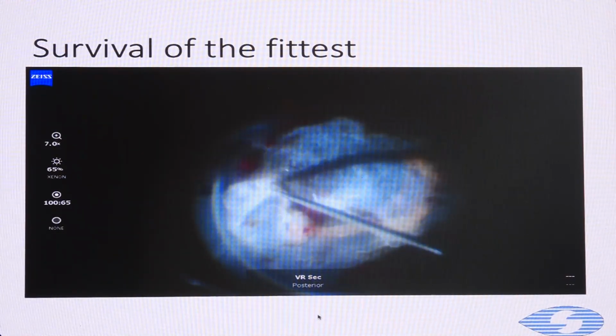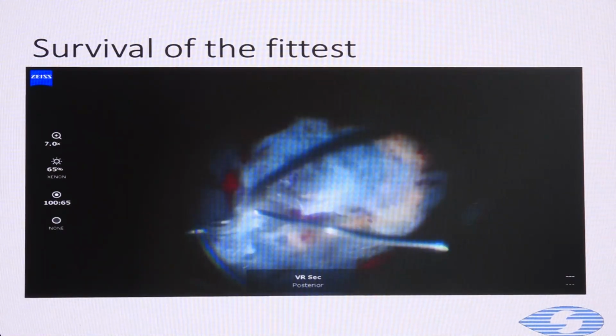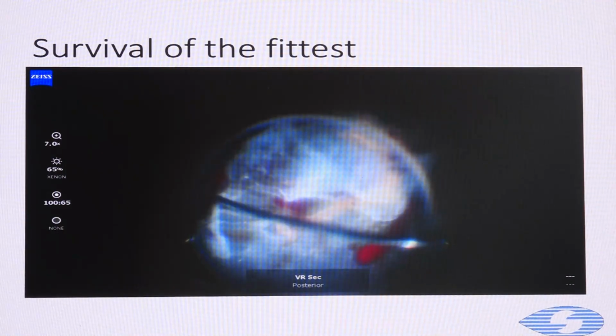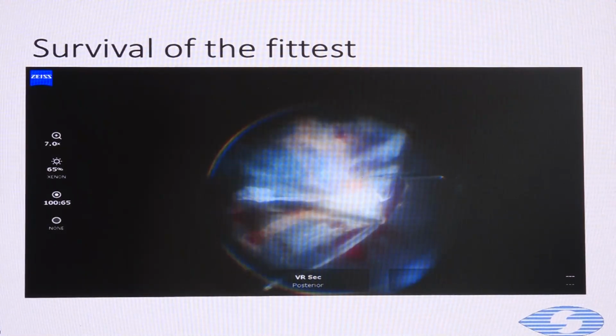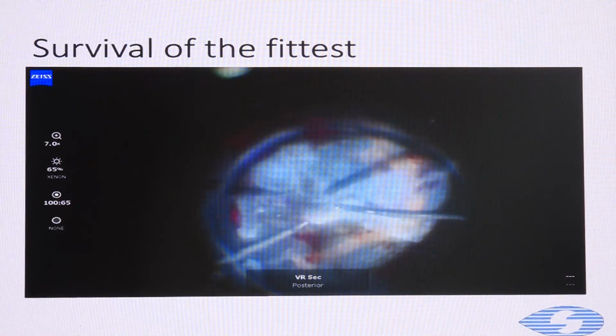This leaf of the membrane is tackled. If you see till the periphery, the attachments are very, very tight. So you could probably find little planes where you can get in and cut them into smaller leaves, but again I think a complete dissection would need a bimanual surgery.